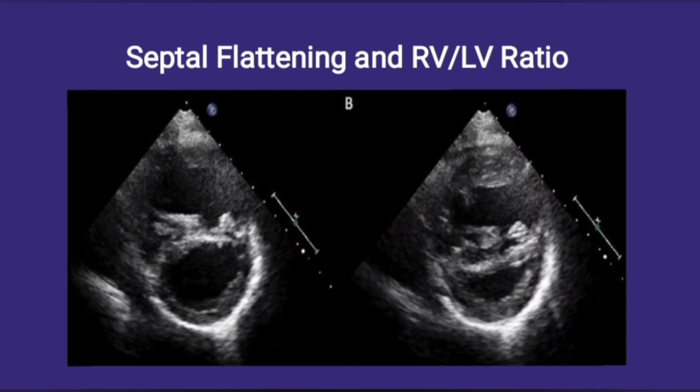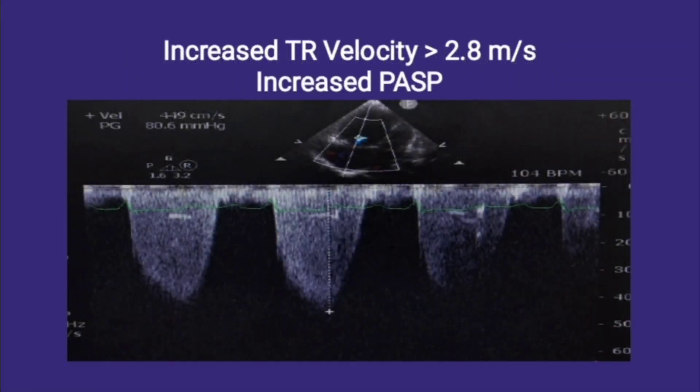The next parameter is septal flattening and RV/LV ratio, which are interrelated. Septal flattening is defined as the paradoxical motion of the interventricular septum in systole and diastole, also known as D-shaped LV cavity. It is a sign of right heart pressure overload. An RV/LV ratio of more than one implies septal flattening. Our next parameter is tricuspid regurgitation, which will also help us assess the pulmonary artery systolic pressure.